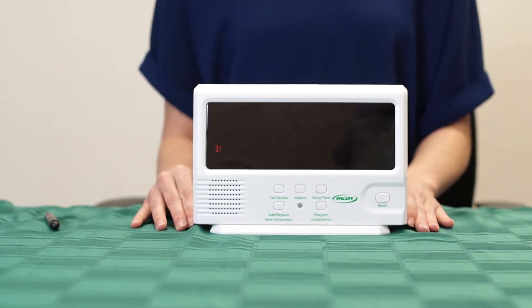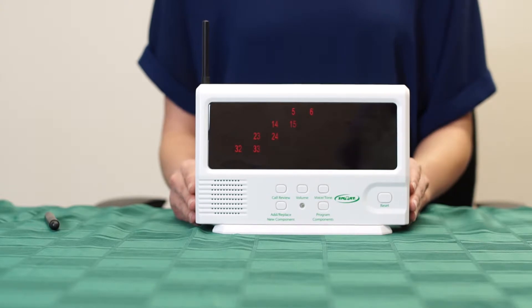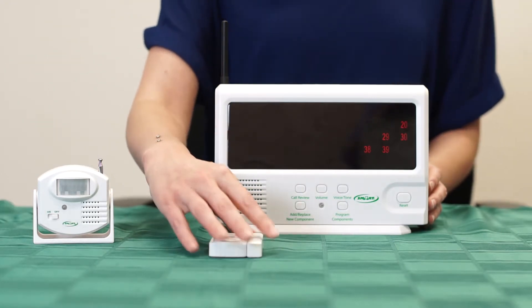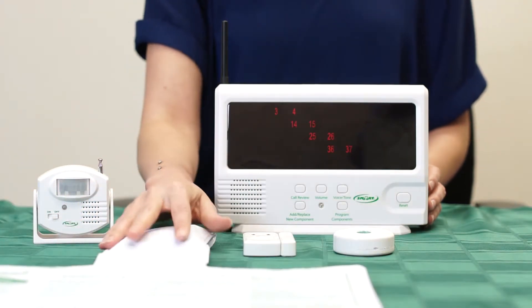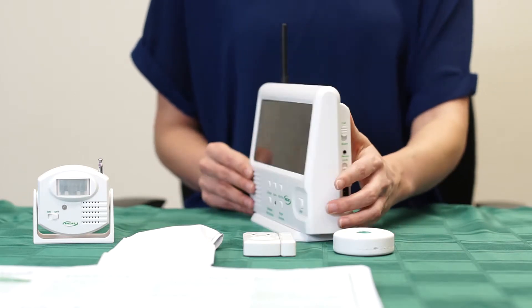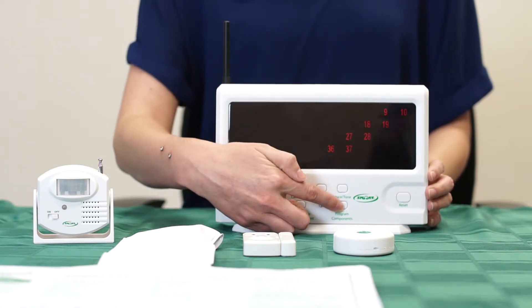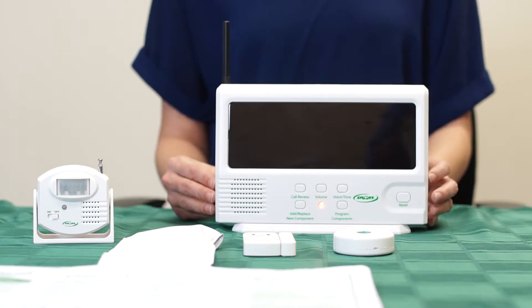Now that you have an idea of the functionality of the central monitor, we can begin with programming. First, extend the antenna on the monitor. Next, make sure that the component or components you will be programming into the monitor are close by. After all components are nearby and ready to program, you must make sure that the lock/unlock switch is in the unlock position. If no components are programmed into the central monitor, you will see numbers scrolling across the screen. To start programming, press and hold the program components button for two beeps and a tone.